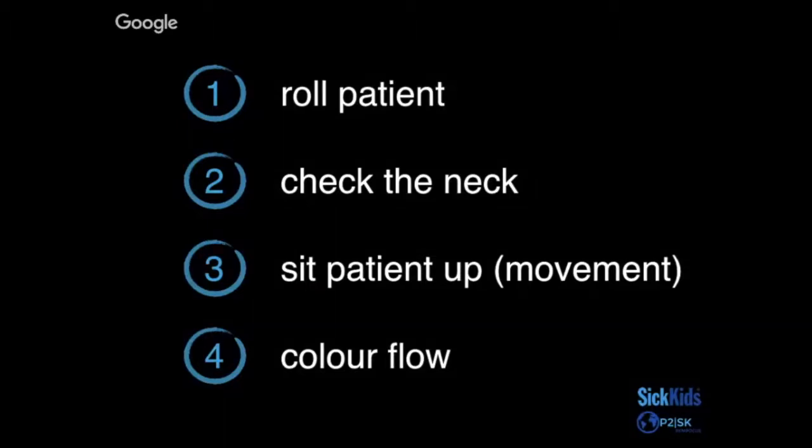We want to always check the neck of the gallbladder, and I'll show you some examples of that. If we identify a stone, if we think it's obstructive, sometimes we can sit the patient up and see if it moves, and I'll show you an example of that.